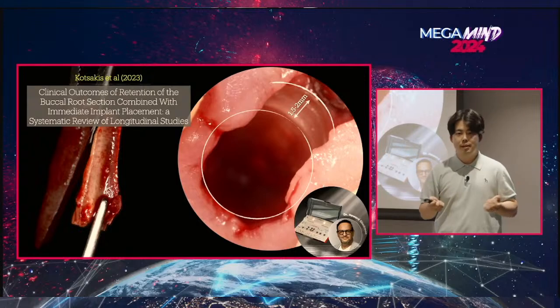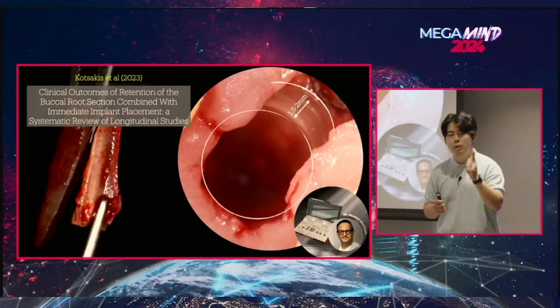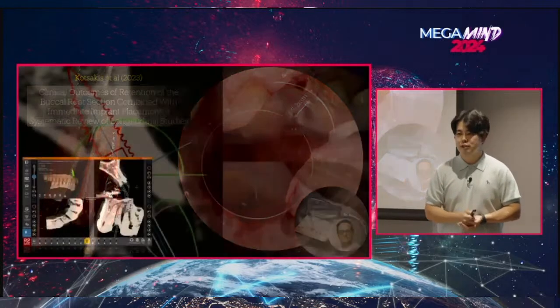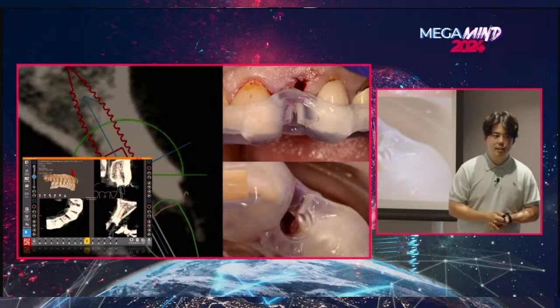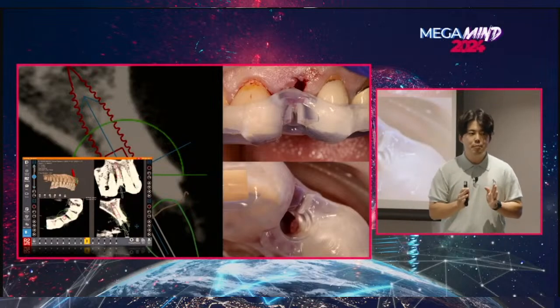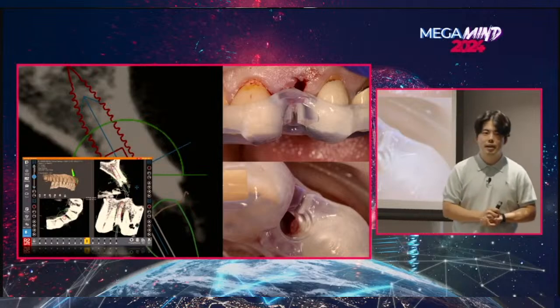And in order to place an implant in a small, tight space like this, we need some help because one little slip and your osteotomy could be ruined. And so we utilize guided surgery. R2Gate is my go-to. Digitally pre-planning allows us to calculate the exact position of the implant that's away from the shield and prosthetically ideal.